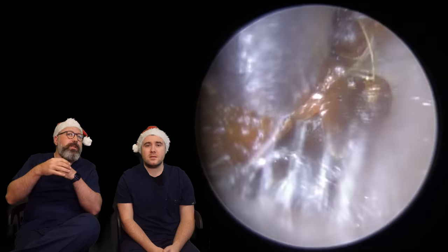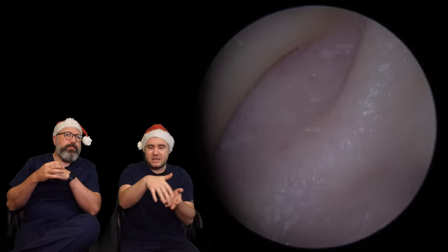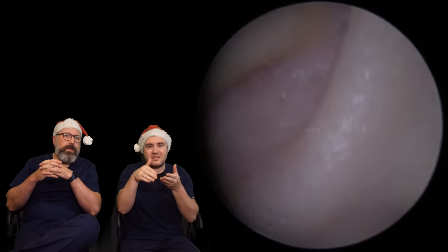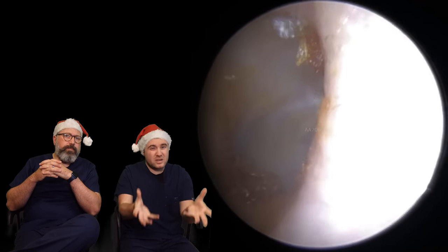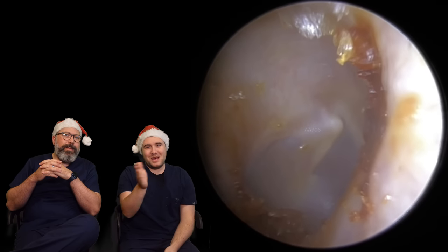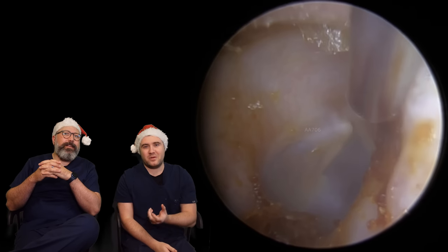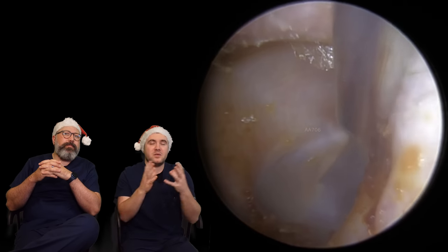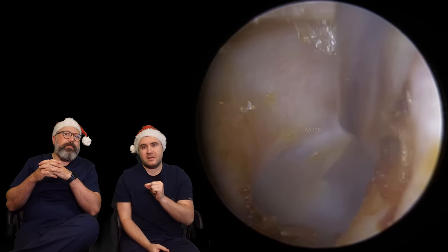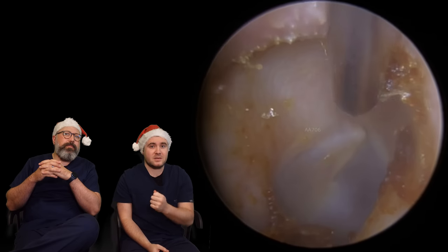The last thing we want is to keep those little bits of sticky wax down in the anterior recess because they'll be a nightmare to get out from there. You can get them out by bending the fine end, but it doesn't always work. And half the time, depending on how deep and how steep that anterior recess is, we can't get the camera in far enough to see down into that. So that's why we want it all to lift out in one go. We've cleared the blockage — we can now see the eardrum. The patient is hearing a little better, even though she mentioned there was no problem with this side.